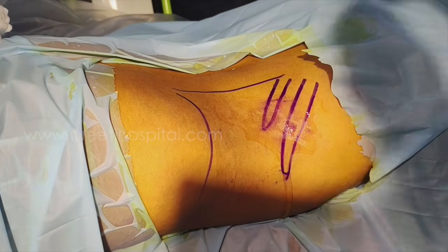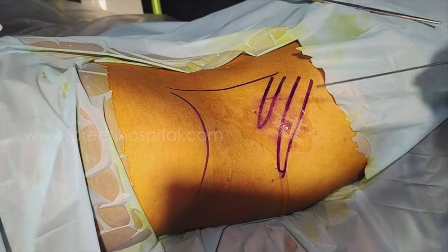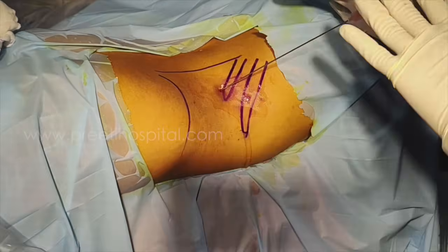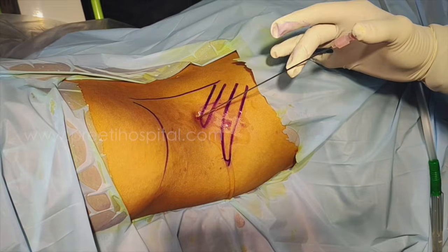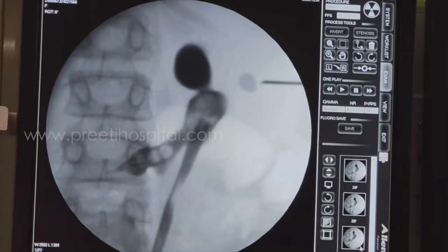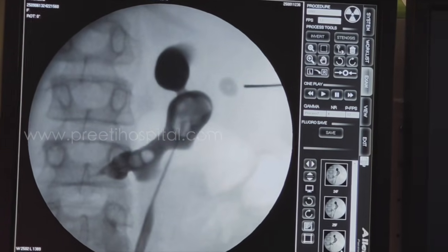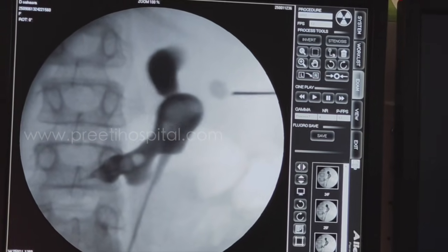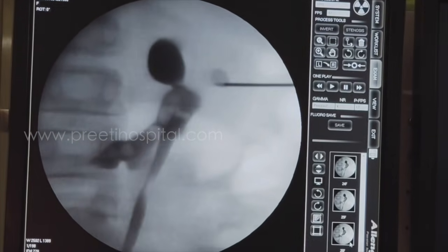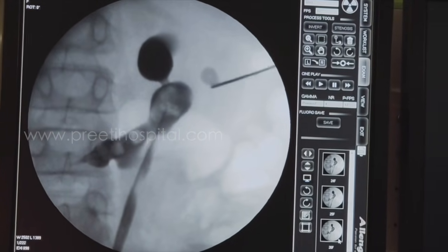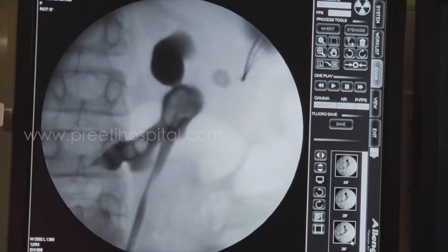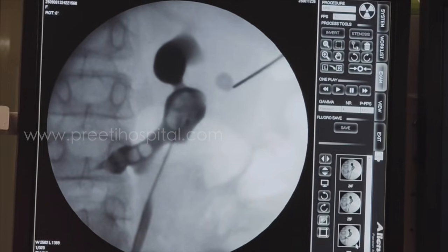Usually the twelfth rib is a good landmark. What do you do in prone PCNL? Most importantly, don't hold the needle — just keep it. It is already superficial, just on the backside. So vertically I am going. Can you see the movement? This is called monoplanar, judgmental technique — not bullseye. My idea is that I wanted to go to the upper calyx, almost in a vertical direction.